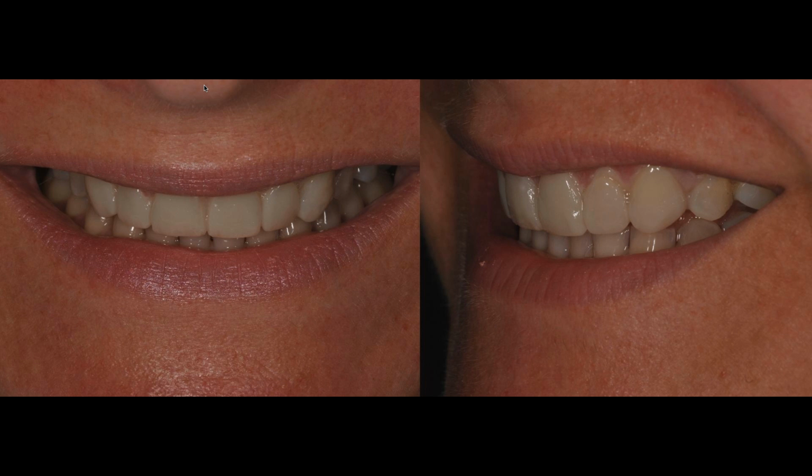In this aesthetic mock-up, we're taking frontal shots, lateral shots, and full face shots. Then we develop a video and have a conversation with our patient, so that we can analyze the incisal edge position. We analyze the canines. Are they giving her canine guidance? Are there any interferences in this new position of her teeth, if we want to call it that way?